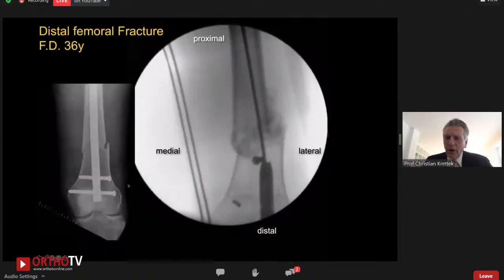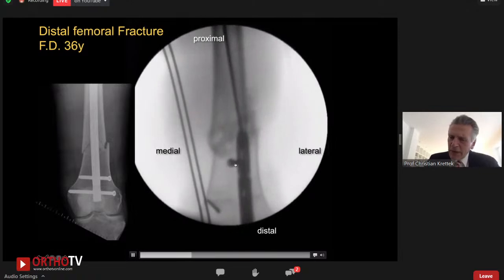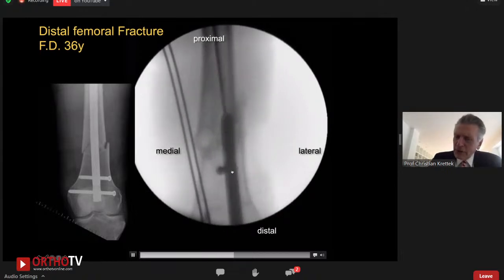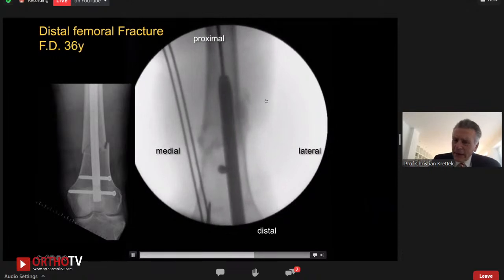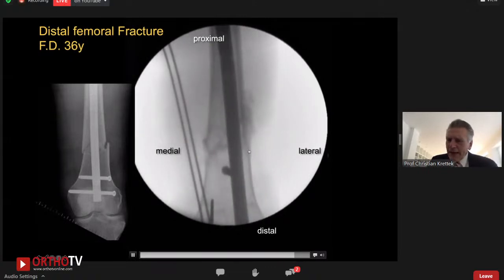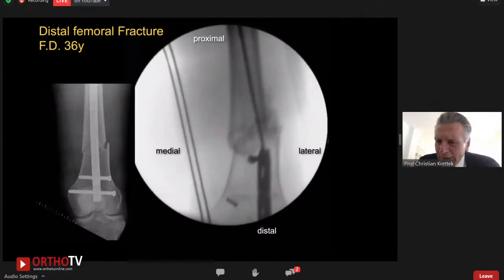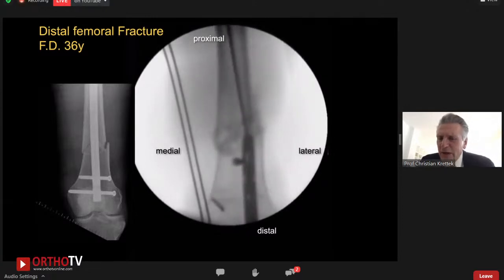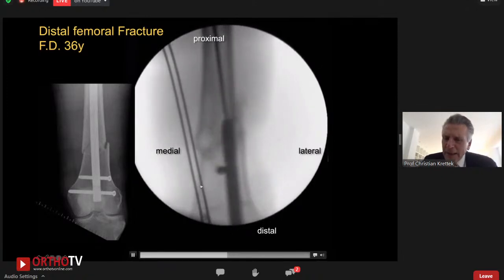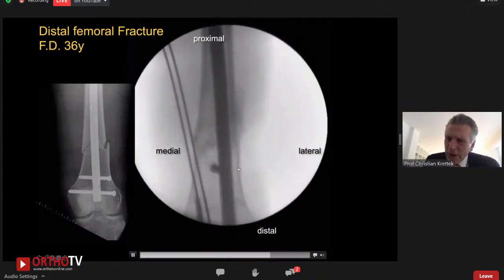So we go back to the operating theater, remove the implant, do the osteotomy at the level and insert a Poller screw, forcing the implant to stay on the lateral side. And once the nail is entering the proximal main fragment, you see how nicely aligned the fracture situation is now, and not only nicely aligned, it increases stiffness of the entire construct by properly placed medial Poller screws, forcing the nail to stay more on the lateral side according to pre-op planning.